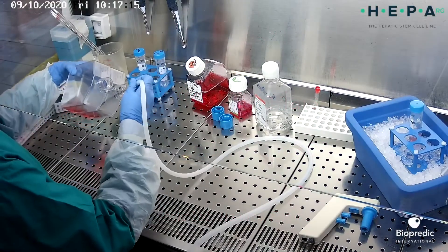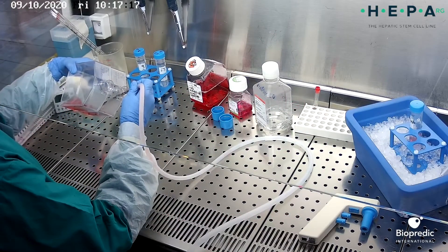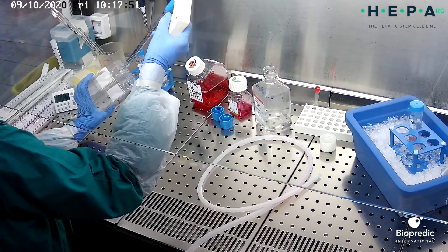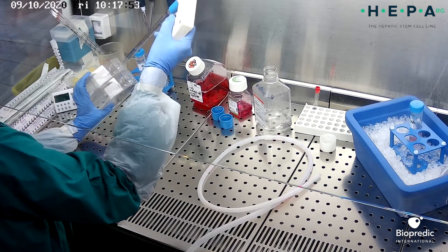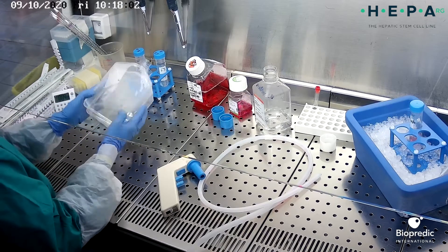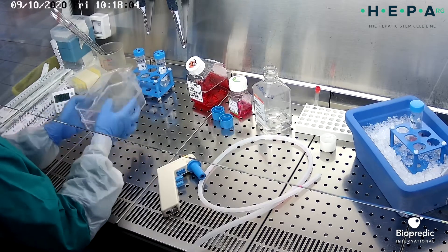Remove and discard the culture medium from the flask. Rinse the cells twice with an appropriate volume of DPBS to remove serum that the culture medium may contain. Let the salt solution cover the total surface of the cell layer.